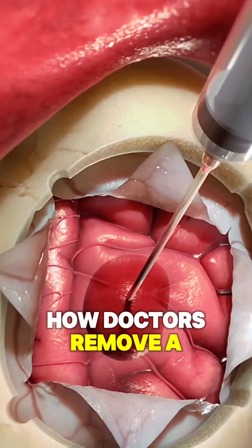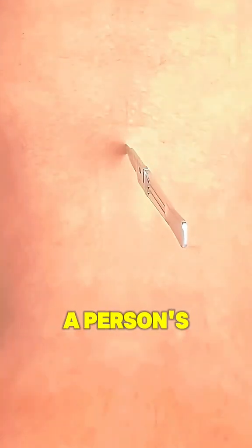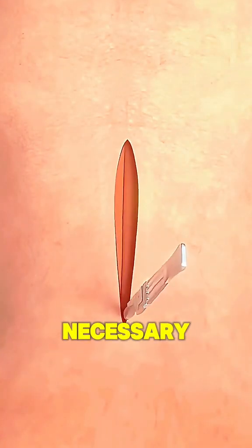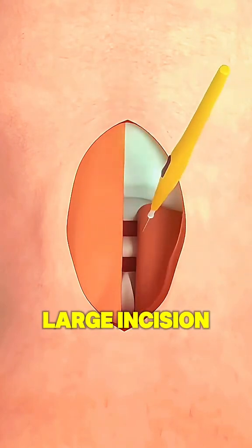Have you ever wondered how doctors remove a blood clot from the brain? A cut is made on the back of a person's head when this treatment is necessary. To perform the procedure, doctors first make a large incision at the back of the head.